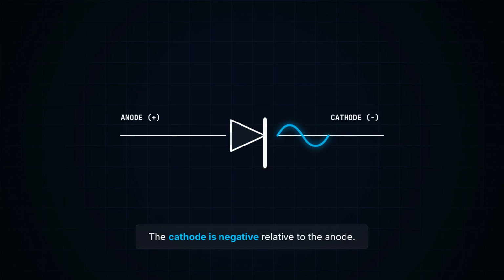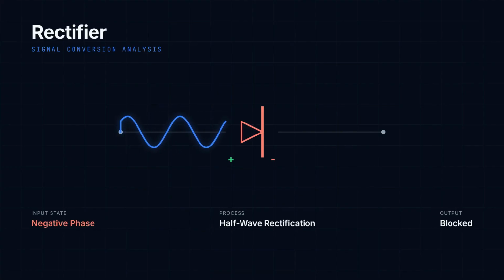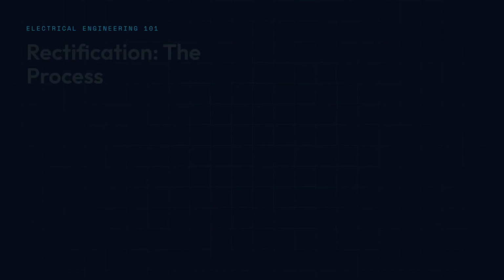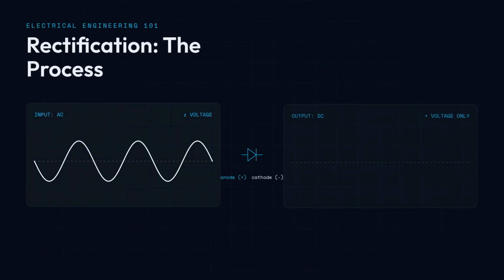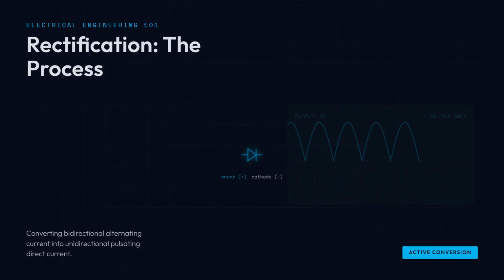That's where rectifiers and rectification become important. A rectifier is an electrical device that allows current to flow in only one direction. Think of a rectifier as an electrical one-way valve. It prevents current from flowing through the X-ray tube in the wrong direction. Rectification is the process of converting alternating current into unidirectional current, so keep these two terms separate. Rectifier is the device. Rectification is the process. In the X-ray circuit, rectification ensures that electrons travel through the X-ray tube in the desired direction, cathode to anode.